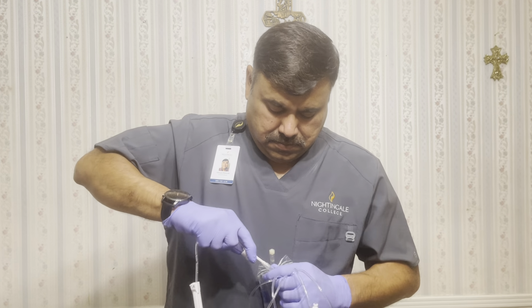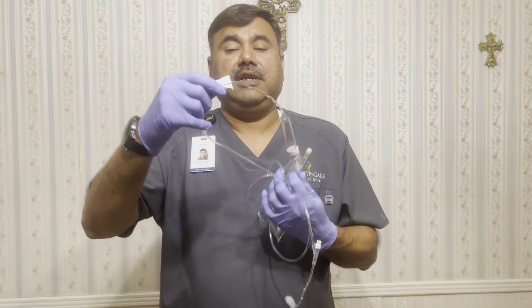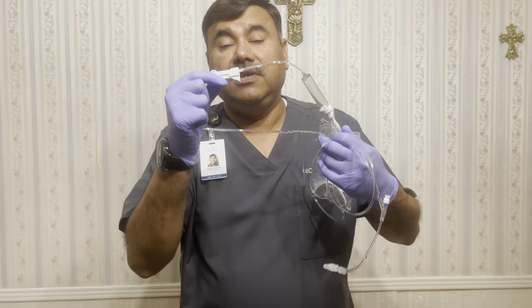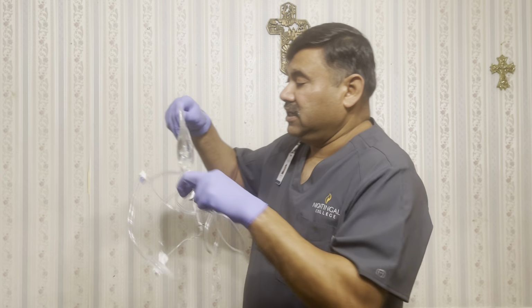Make sure before that my roller clamp is off. Otherwise, all my med will flow out. So let's hang. There's my first bag, that is my fluids.